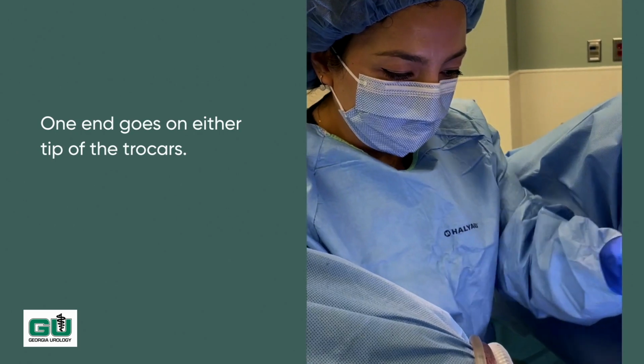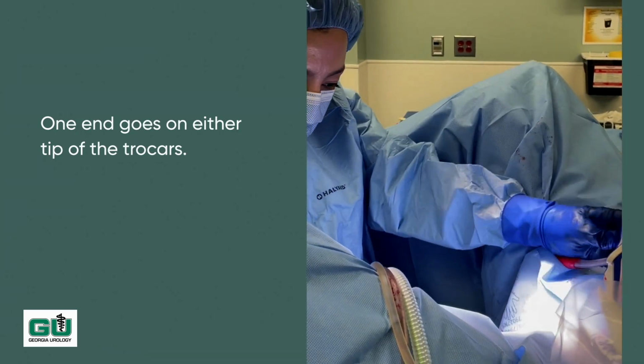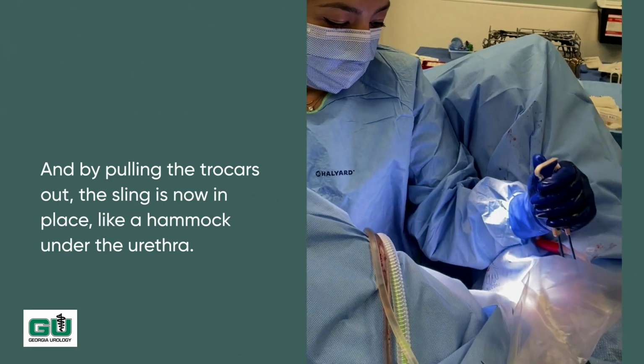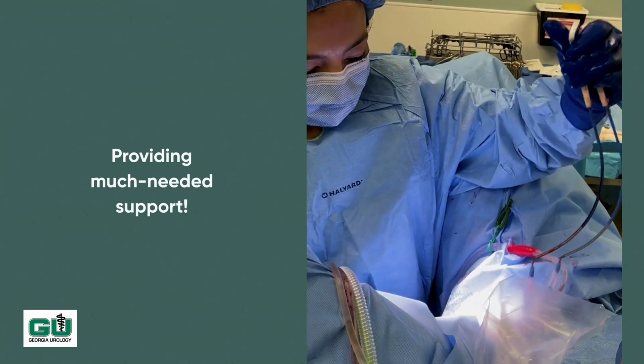the left one. And then I carefully pull the trocars out of the patient's body. And as I do that, the sling then rests under the patient's urethra like a hammock, supporting it nicely so that when she coughs or sneezes, it no longer moves and causes incontinence.